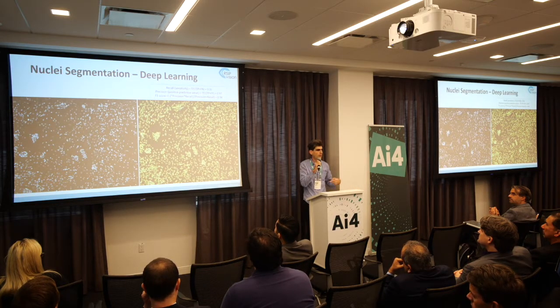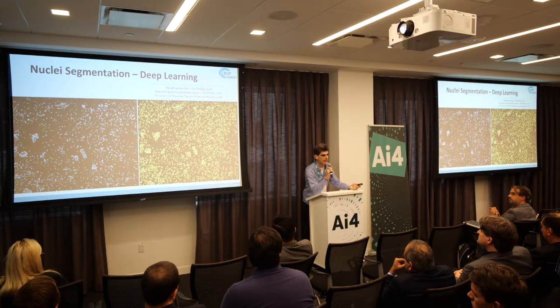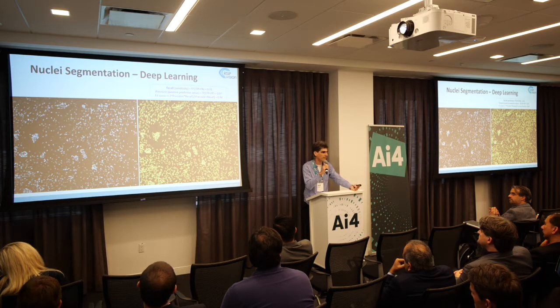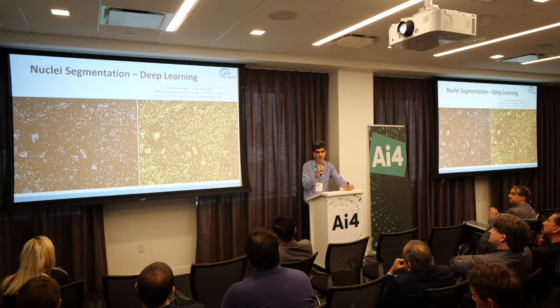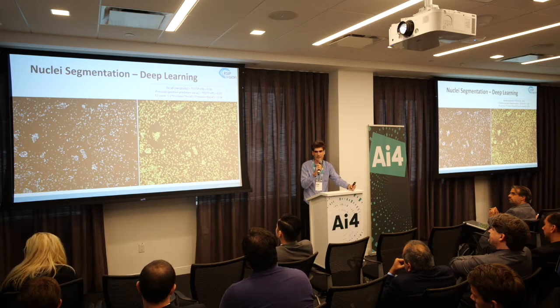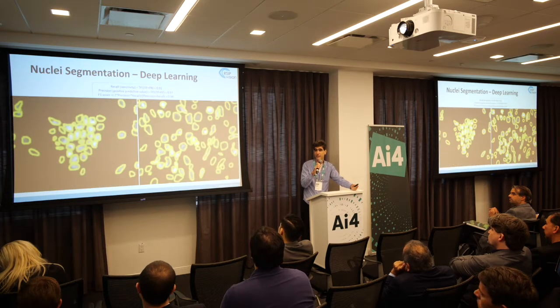Actually, along the way, when you're iterating this on various versions, you're doing a training set and a validation set and doing another version of the algorithm, you tend to find lots of errors in the ground truth annotation when you start to look at the network errors. So some of the errors you're going to find when you're developing the solution are really going to be errors of the neural network, and you need to try to get some insight on this. Sometimes you can, and sometimes you can't. Sometimes you say, yeah, I just want more data. Sometimes you have specific failure cases. There are always going to be failure modes in the reverse where you find errors in your annotation thanks to your neural network.